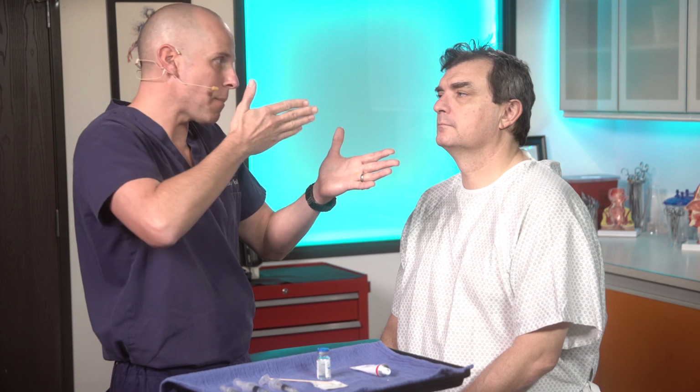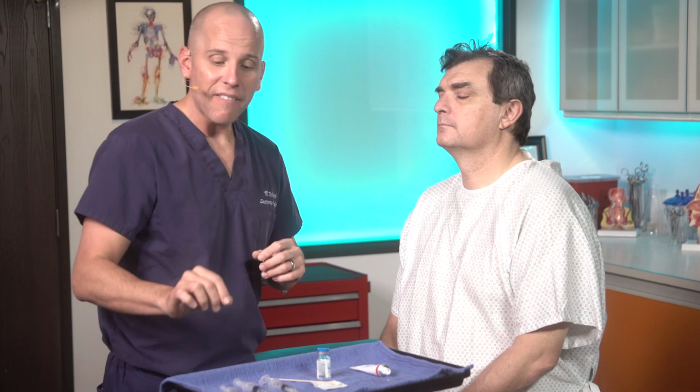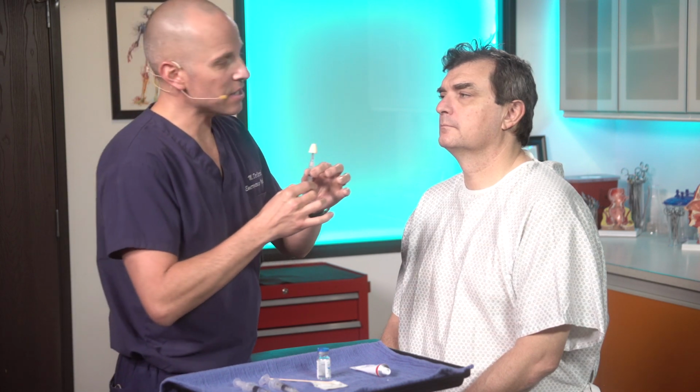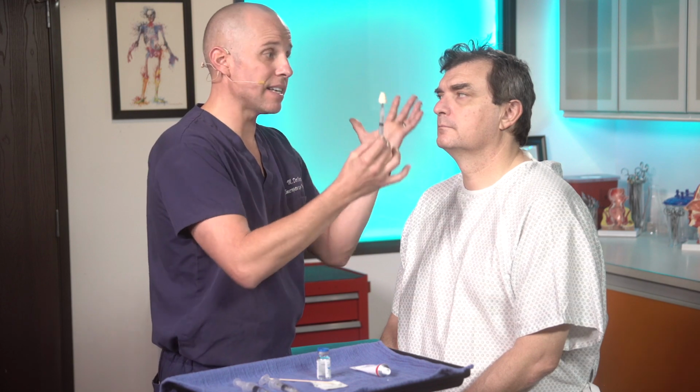Remember, in the anatomy, the Sphenopalatine Ganglion is inside the nare, right posterior to that superior turbinate. And so similar to when we're doing an epistaxis packing, you're going to want to think about that anatomy and how you're introducing your topical anesthetic. I've added something to this that isn't really talked about in literature in terms of doing the actual block, but I like to do a little atomized lidocaine, 2% with or without epi. This one's without epi. Just a little half cc atomized into the nare prior to actually doing the Q-tip with the topical anesthetic. I find that it makes it a little more comfortable for the patient.